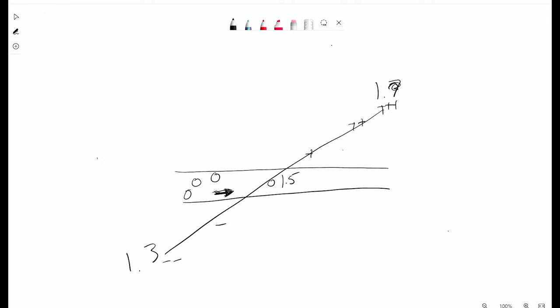I know it's a little off subject, but the steeper your ramp up is, that is when people get stimulation. The larger the difference between when your gradient's off and on, the more stimulation. You're never going to have peripheral nerve stimulation at isocenter, because there's no difference when it's off or on. You're always going to have peripheral nerve stimulation 20 to 30 centimeters away from isocenter. So that messed me up at first.